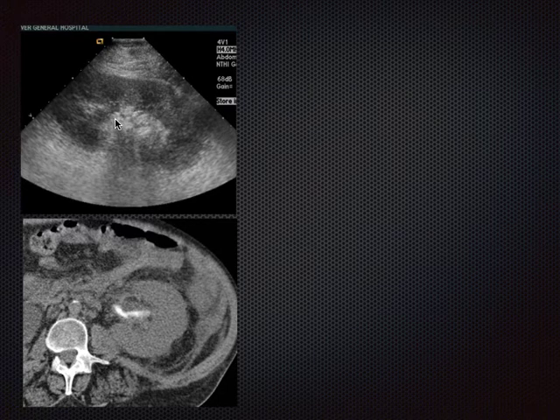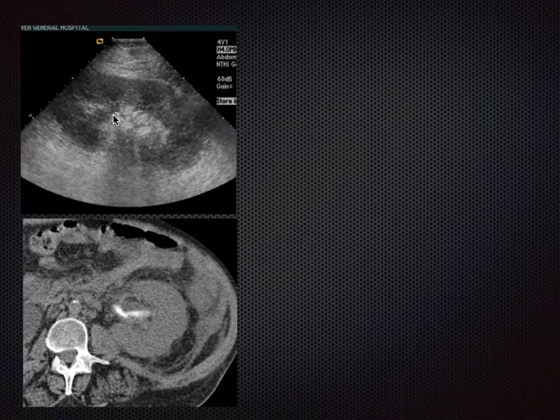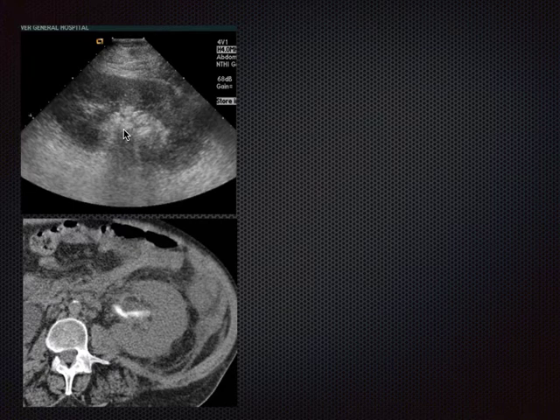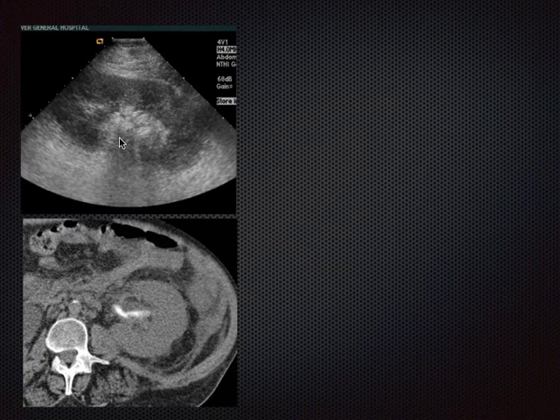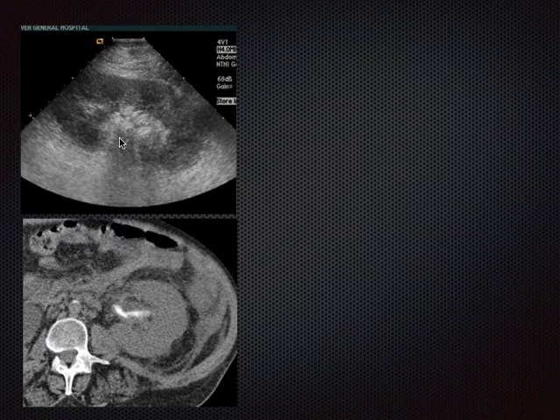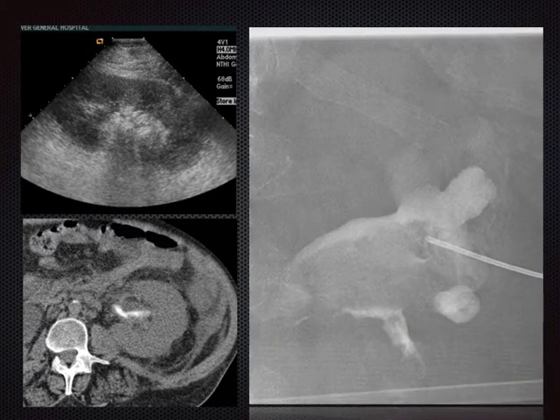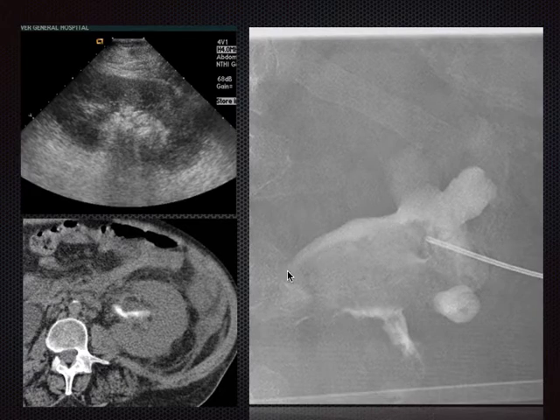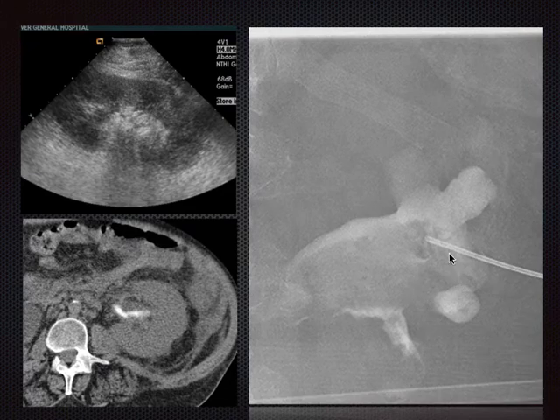Important caveat: when you have a big stone and no hydronephrosis, it can be difficult to evaluate the true extent of the calculus. This patient was septic with a very large stone in the renal pelvis—we're only seeing the tip of the iceberg. This is particularly problematic in branch stones or patients with an extrarenal pelvis where a lot of the stone extends medially. At the time of nephrostomy, the stone was quite a bit larger than what we appreciated on ultrasound—we were only seeing probably part of the calculus.